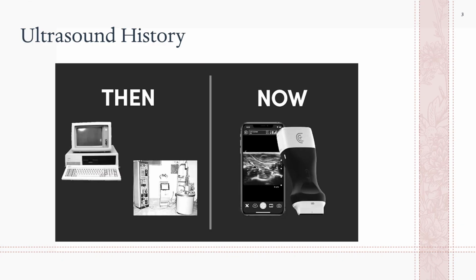I just thought it was kind of cool and wanted to mention how we optimize our images and how we take images are very different from when ultrasound first started. Nowadays, they are developing technology where we can start scanning on mobile devices, whether it's an iPad, a phone, a tablet, or just a portable computer. And they're even building technology where you can have a wireless transducer. So ultrasound has come really far and is constantly changing throughout the years.